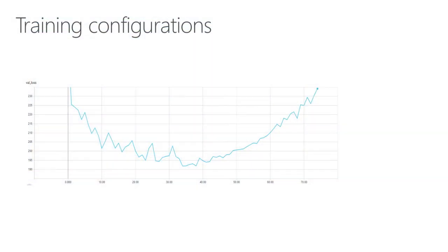Awesome. So I saw you had a chart coming up next. What is this telling us? So actually, this is just the training chart. As you can see, this is the loss of the model. From the first few epochs until maybe the 30th epoch, it just decreased. And then from there on, the validation loss just goes up because we are overfitting on the training data. Got it. And so you're like, okay, we're going to pick the model right there at the bottom because that's the one that does the best. Yeah, let me just select this one. Awesome.